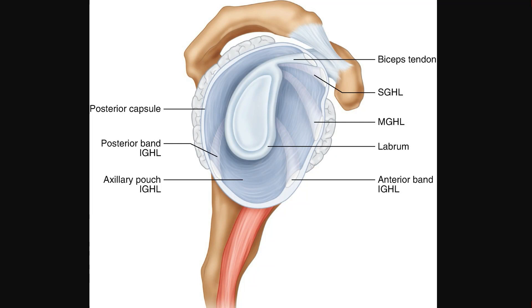Just a quick reminder regarding the anatomy. This is a sagittal view with the glenoid. We have the inferior glenohumeral ligament complex, which comprises an anterior band and a posterior band — the anterior one being the more important and thicker one. Then we have the axillary pouch, which is a thinner structure.